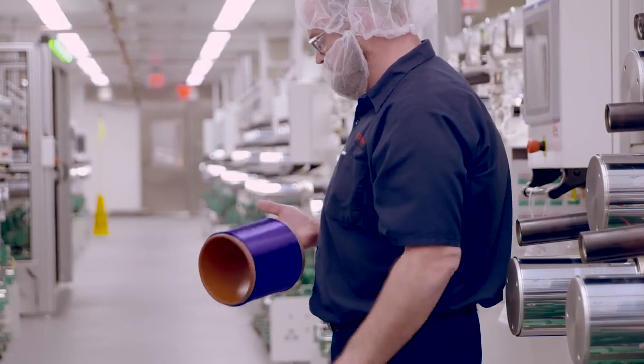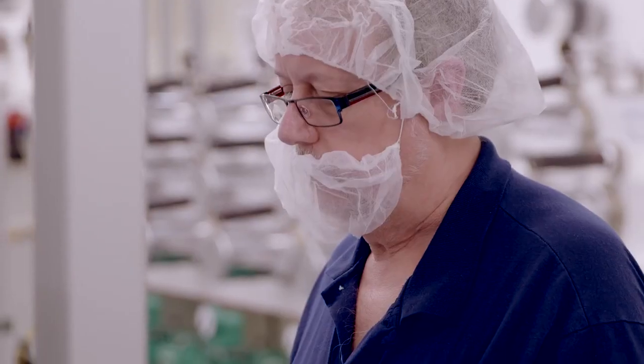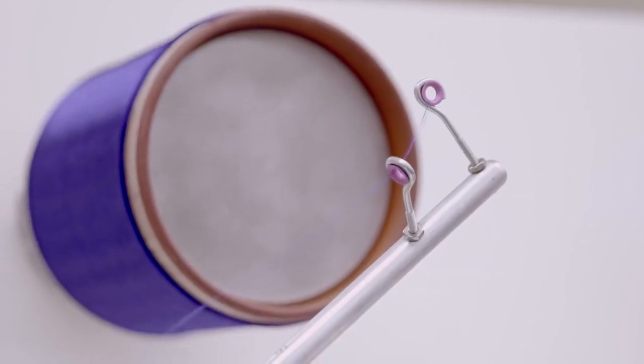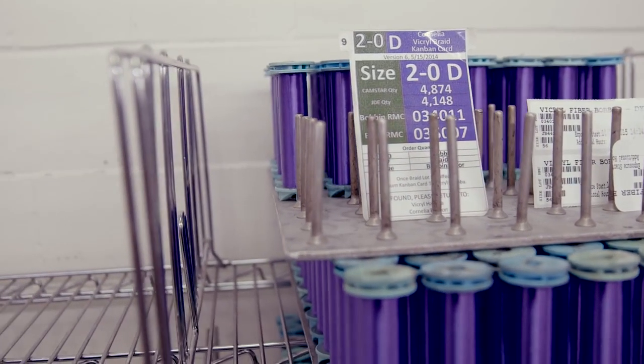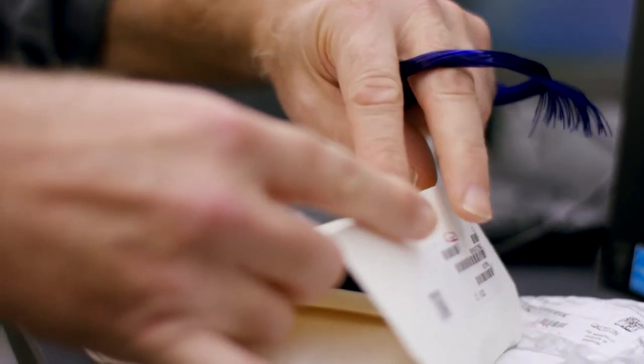You know, it's like making spaghetti, but very important spaghetti. The care and control that each of the operators have in terms of making sure we're following our recipes appropriately. It's a pretty nice process. Absorbable sutures have a limited number of days between extrusion and getting to a finishing plant. Otherwise, the suture is unusable. We have to move that material through the process in a certain amount of time, or we actually have to throw it away.